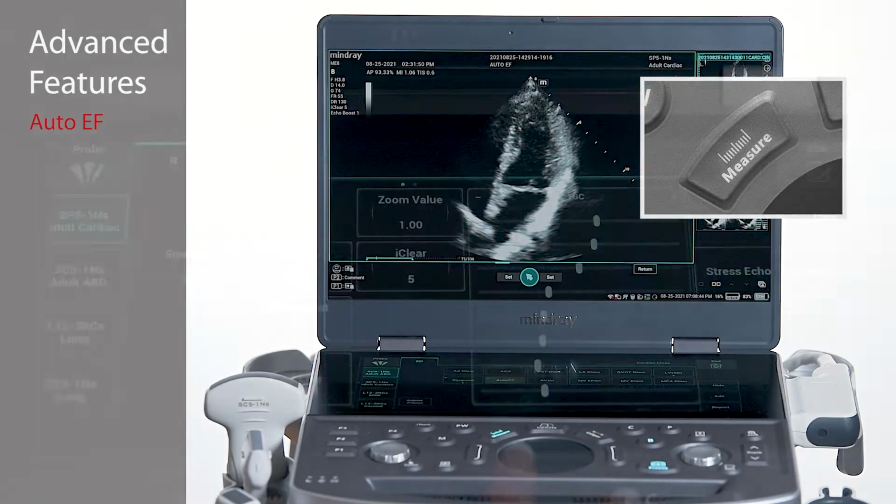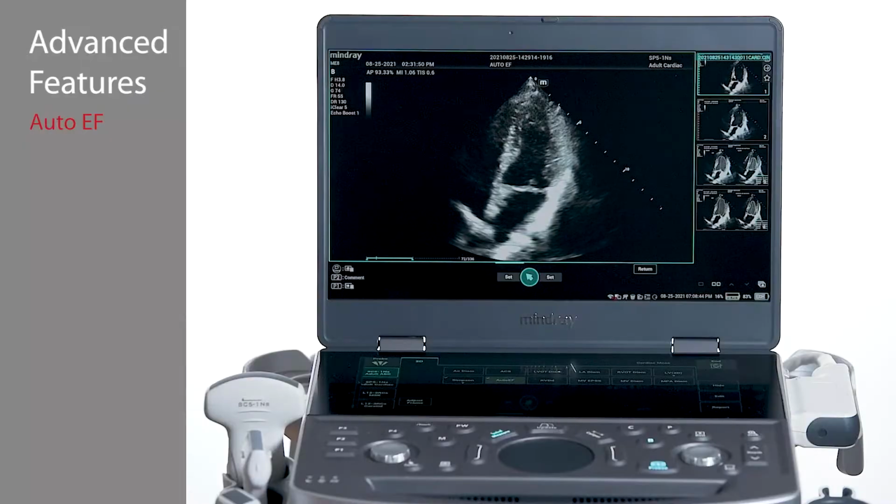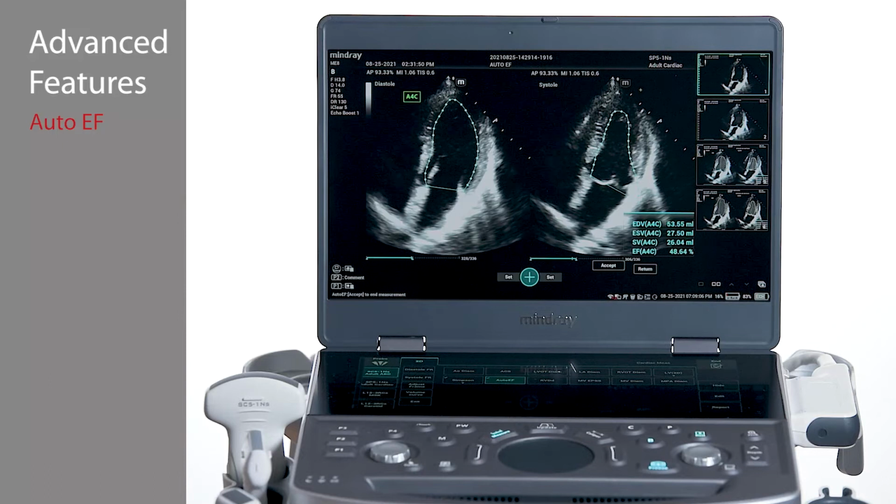Press Measure, then choose AutoEF. The system will automatically analyze and trace the left ventricular chamber in both diastole and systole, providing ejection fraction and volume data. The placement of the tracing points can be adjusted manually if needed.